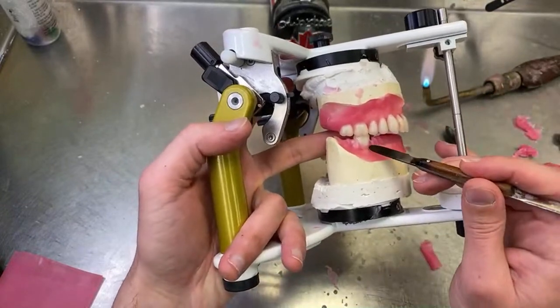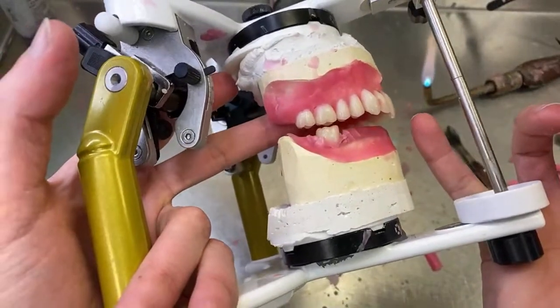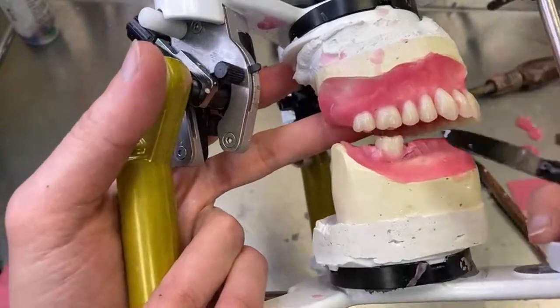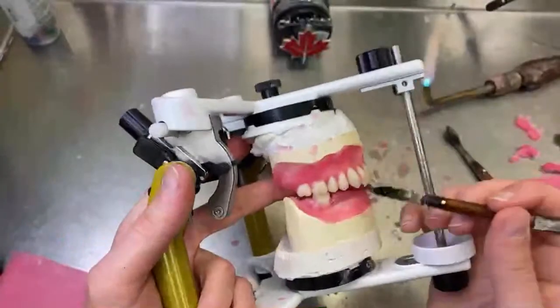Like that. See where it's sitting? Those two cusps will line and those two lines here.